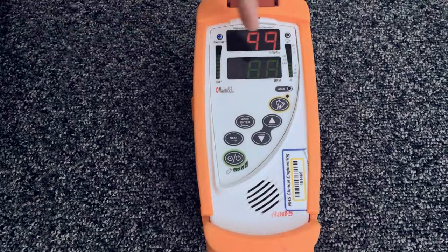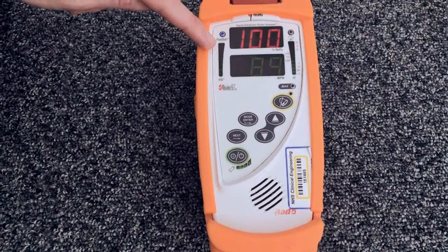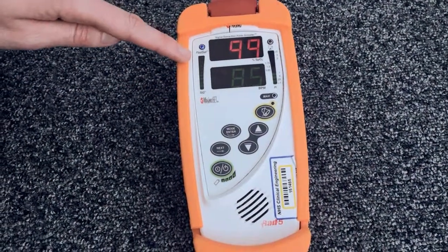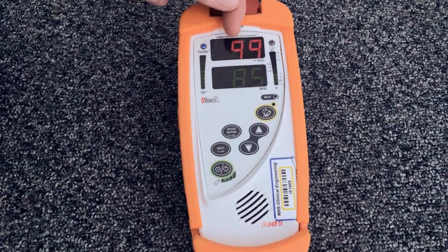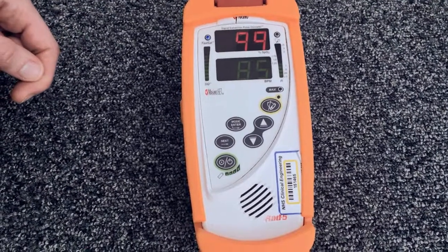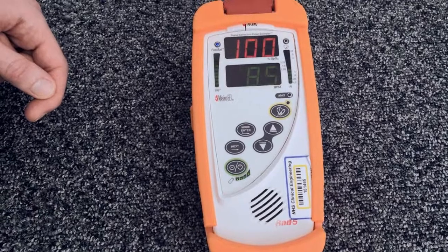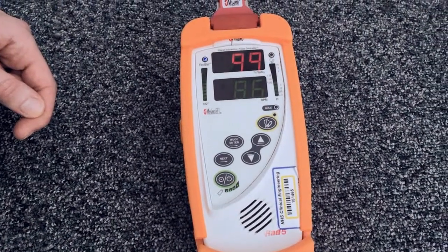Either side of the display are some green dashed lines which load up when the machine is picking up a good trace. If these lines are red, this shows there is a poor signal from the probe and you may find that these numbers jump around a lot and display lots of different readings. If this happens, try to reposition the probe, check all the connections and allow your child to settle. It might be necessary to give them a cuddle or to distract them with a toy.